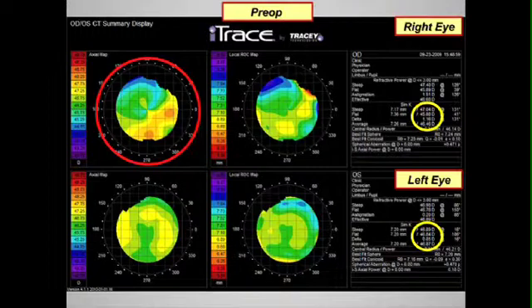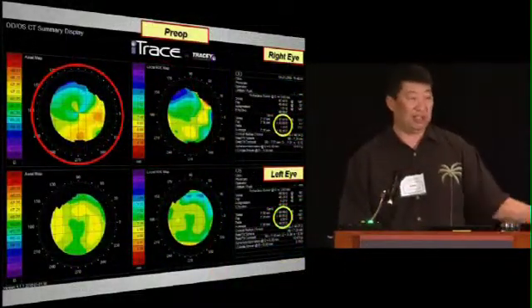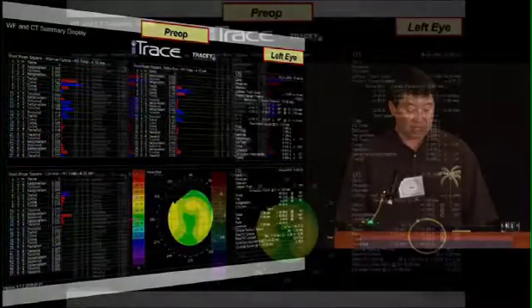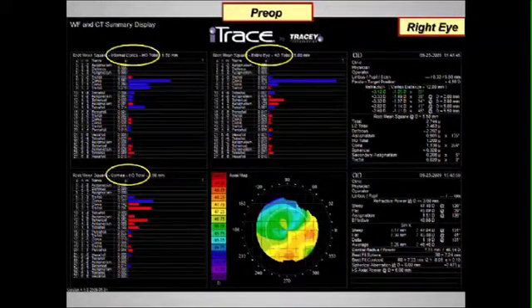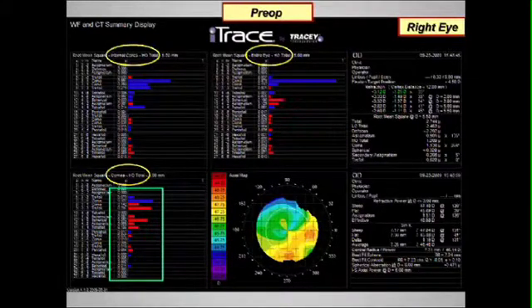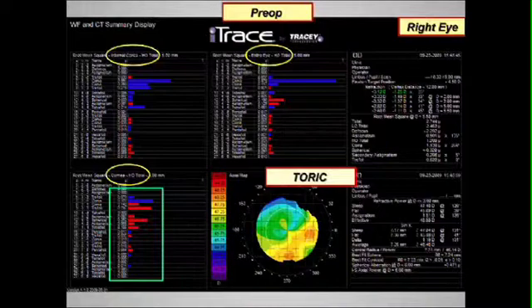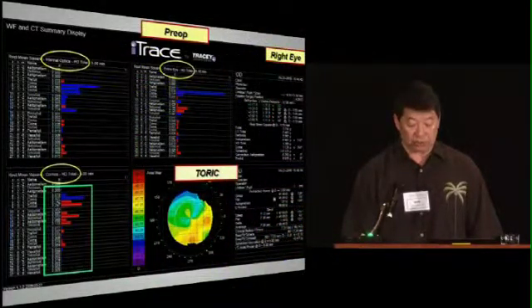Here's this topography — is that okay? For someone who hasn't been doing LASIK their whole career, nobody has a normal topography when they're 70; they don't look like 30-year-old topographies. So you do the wavefront. That's the left eye — that looks pretty good. Again, as Bobby said, those aberrations are from the cataracts. But look at all the aberrations in the right eye — there's no way I want to put a multifocal there. That means, in this case, a toric IOL. And I think Kevin's going to talk about that. Here's the SIMK — K readings just from that ring — and then this K up here is the refractive K, from the best fit for the entire area, and that's what I use for my toric IOL.